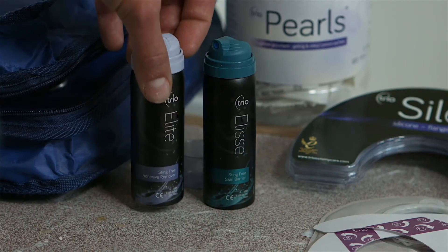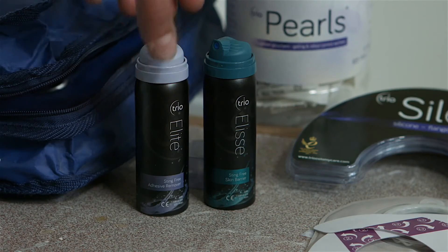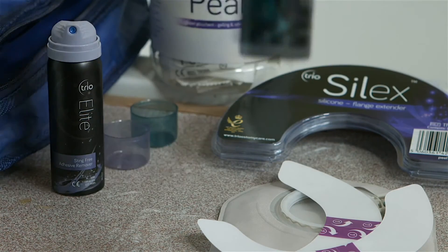The Elite Spray really gets rid of all the sticky residue that can sometimes be left under a bag and gets rid of all of it. All the little black marks, everything really easily — some of the other sprays don't quite get the fine film of residue off.